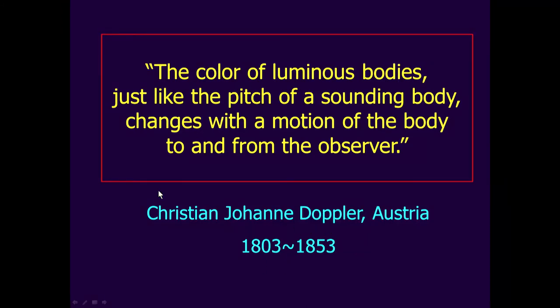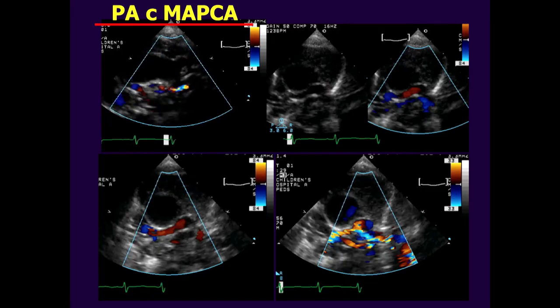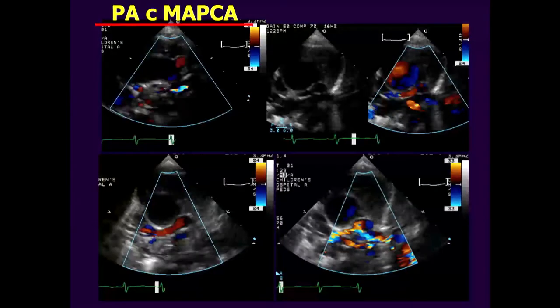Doppler says the color of luminous bodies, just like the pitch of a sounding body, changes with the motion of a body to and from the observer. So this is echo, he defines. And then let's look at these images.